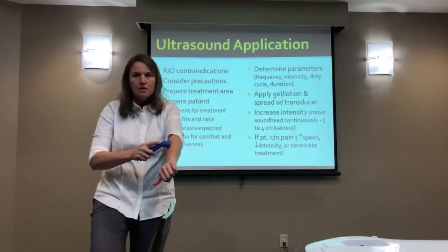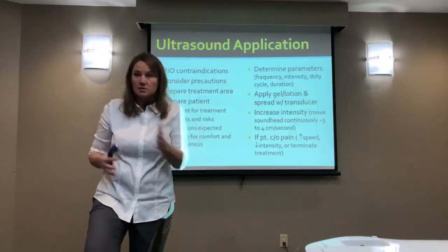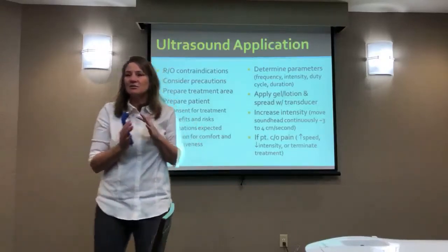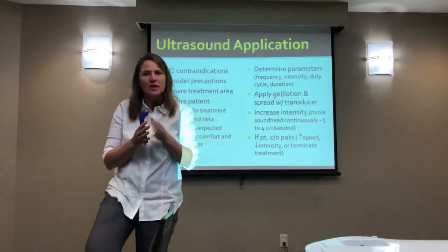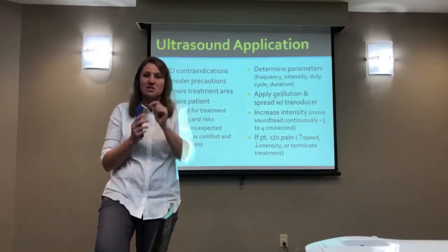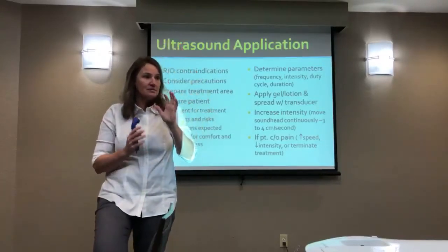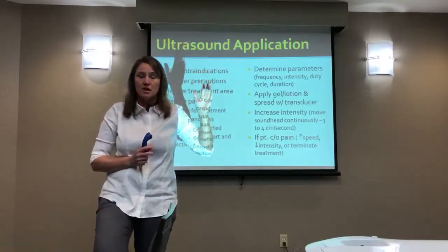Starts to get uncomfortable, go bigger, goes away. I mean, don't do it a bunch of times because we don't want to end up looking like cooked chicken, isn't that what they said? But regardless, don't do it for a long time, but it's a good learning experience to know that, boy, we can go, just a slight change in speed and space can tip the scales from a little bit of heat that's maybe therapeutic to harmful levels of heat that hurts.